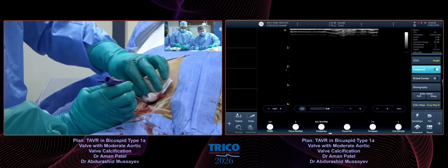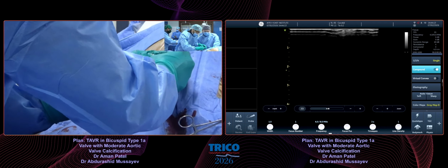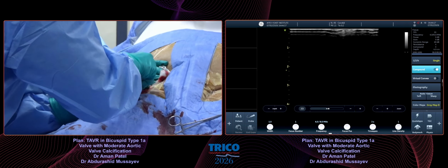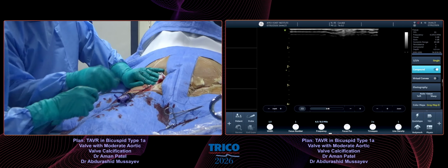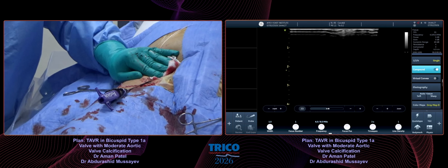So this is facing 12 o'clock if you choose to use single ProGlide and one angioseal, isn't it? Yes. Thank you. As Rajiv said, there are institutional protocols. Within my institution, I always use 2 Percloses. So two Percloses, okay.